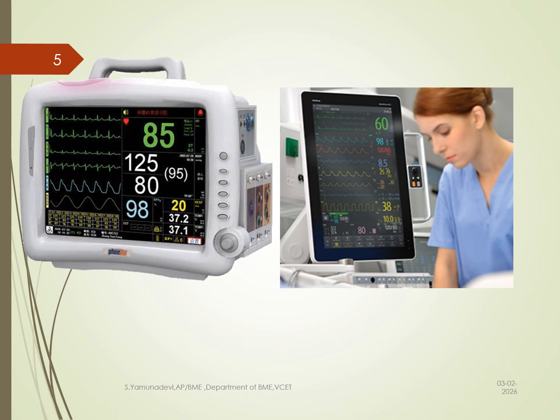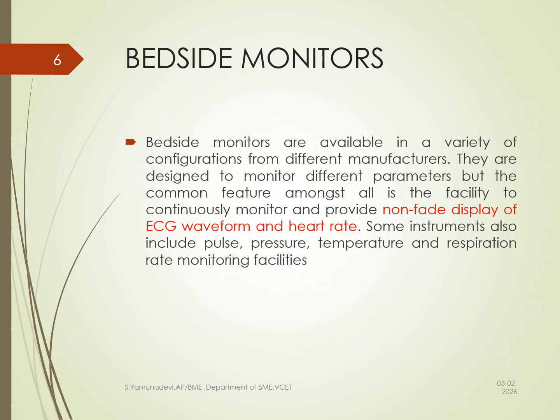And this is one of the bedside monitors. It displays the basic vital parameters. Mostly these bedside monitors are available with a non-fade display of ECG waveform and heart rate. And most of the instruments have pulse, pressure, temperature, and respiratory rate monitoring facilities. Depending upon the manufacturer, the parameters will be included.